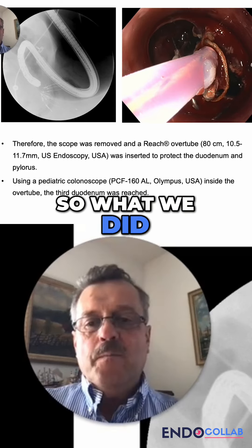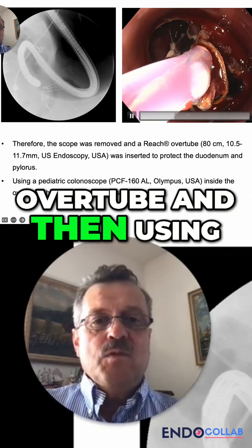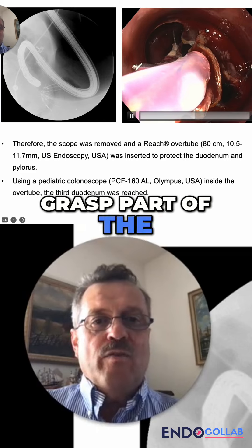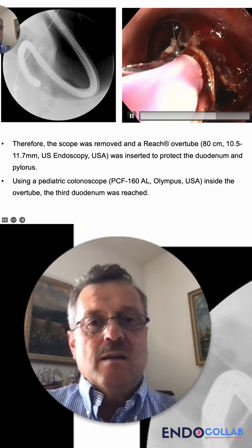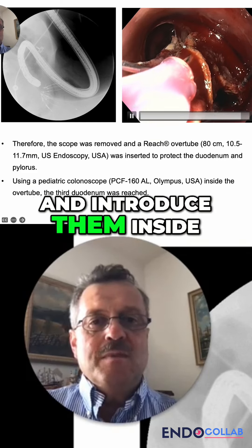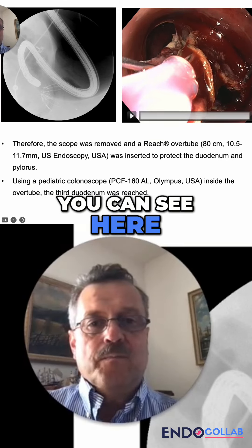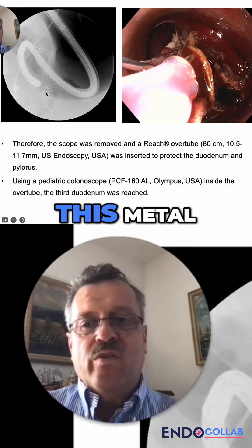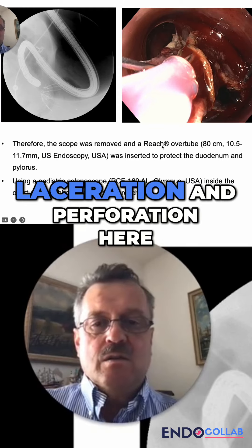We placed an overtube and then using the hook we were able to grasp part of the metal crown, dislodge these barbs from the mucosa, and introduce them inside of the overtube, as you can see here. It is very important that all the metal is inserted, otherwise with this metal if you just pull you would cause a big laceration and perforation.